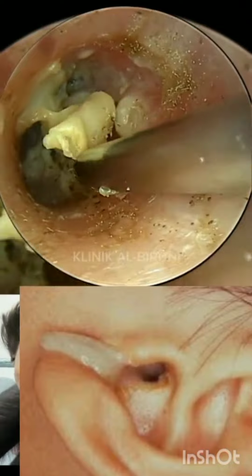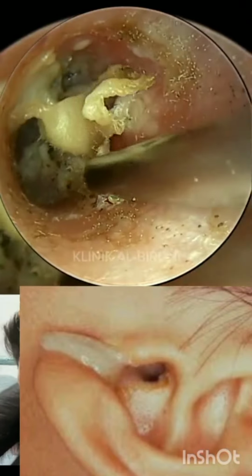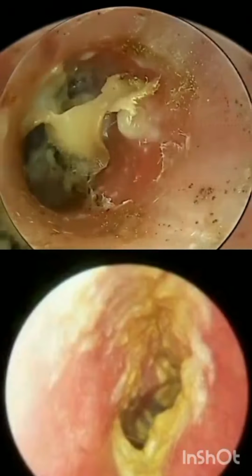Some people can use a soft cotton pad, but this is the most effective way. It minimizes trauma to the ear. Remember, this is a very soft, delicate area.